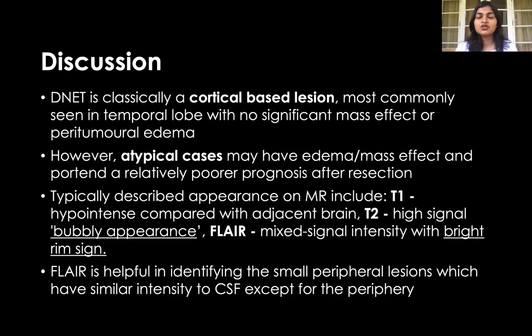Typically described appearance on MR includes T1 hypointense, T2 hyperintense, that is a bubbly appearance. FLAIR shows mixed signal intensity with a bright rim sign. FLAIR is helpful in identifying the small peripheral lesions which have similar intensity to CSF except for the periphery.